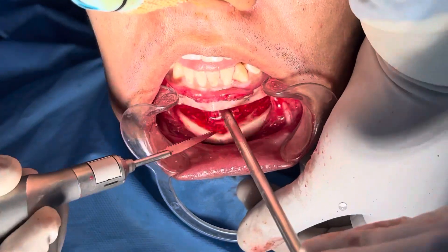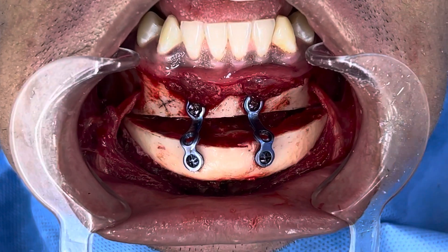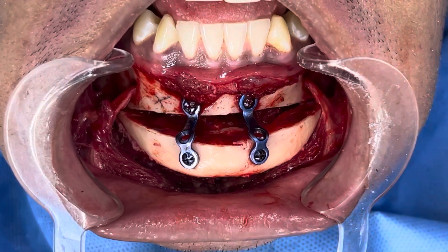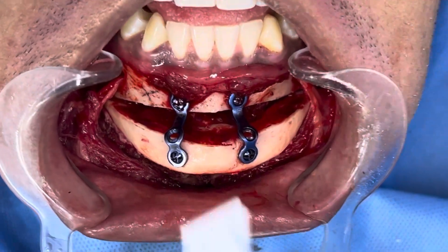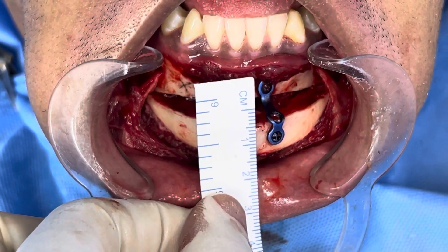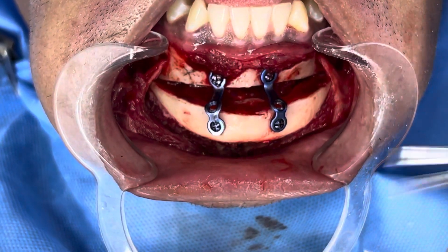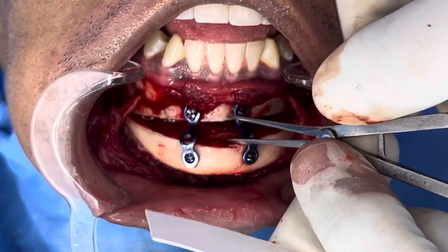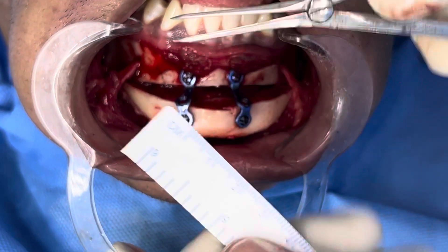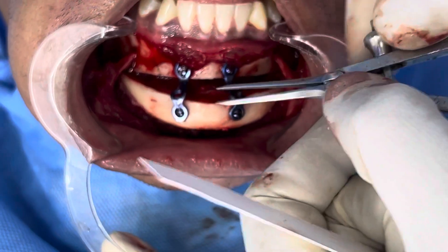So just on the osteotomy — chin augmentation done: permanent, predictable, safe type with bony osteotomy. I'm going to show you with the scale the vertical improvement or increase in height, which translates to five millimeters. I'll double check — yes, that's the gap which relates to the vertical augmentation, and you can see it's five millimeters. Now let's move to the horizontal part.